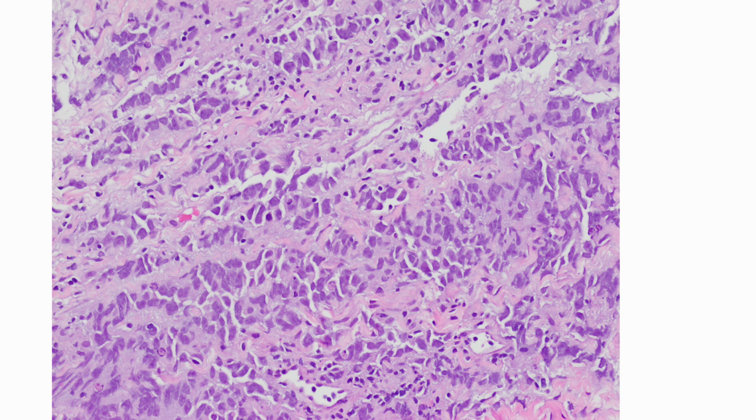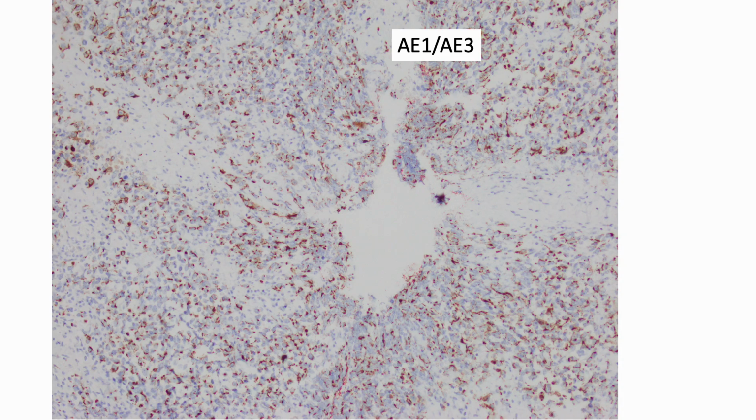Morphologically, this was a difficult case. There were few definitive clues. The differential diagnosis included carcinoma, sarcoma, lymphoma, melanoma. Immunohistochemical stains were performed to help narrow the differential.